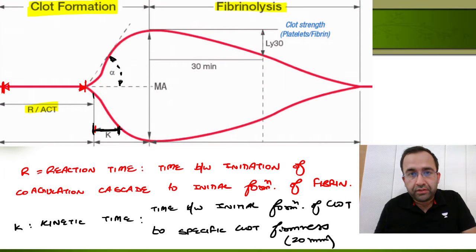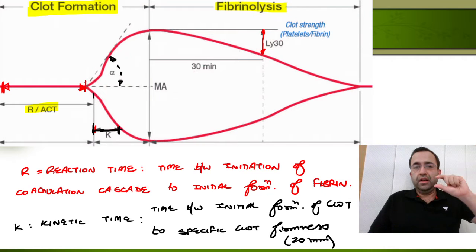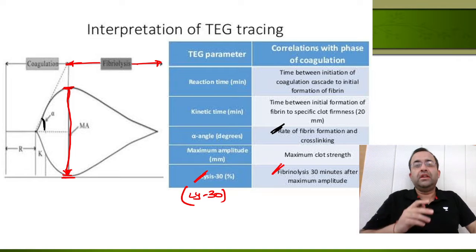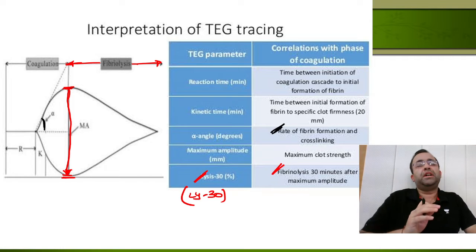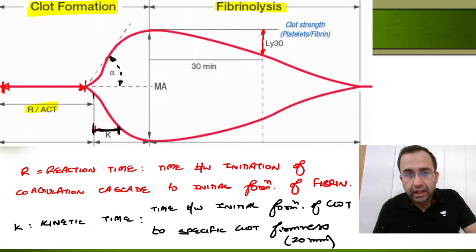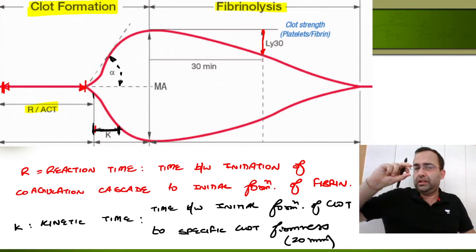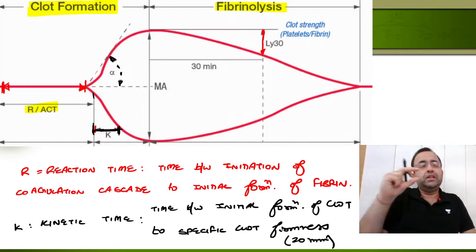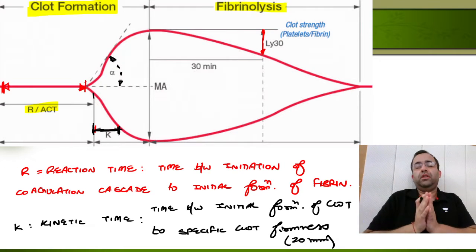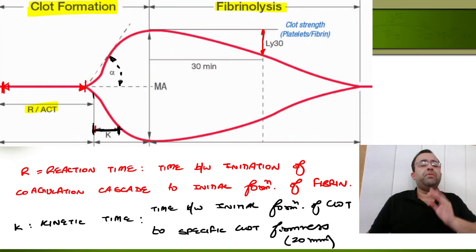This is fibrinolysis 30 minutes after maximum amplitude, the extent of fibrinolysis after 30 minutes of maximum amplitude.